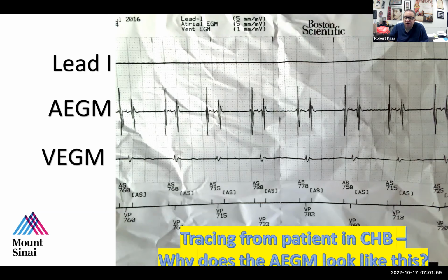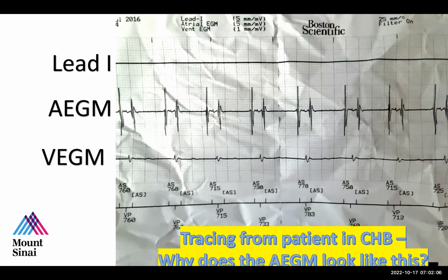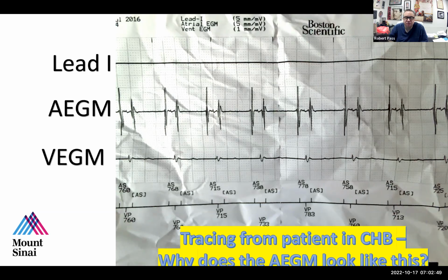So, Tarek, why do you think it is that the atrial electrogram looks the way it does? Well, what's unusual about it? It's like I see the recording of the atrial contraction, but then it's followed also with the ventricular recording too. It's matching it. Mm-hmm. That's astute. I agree with that statement.